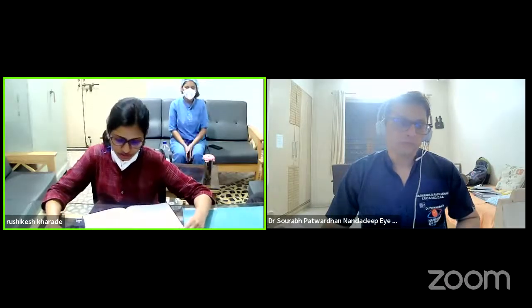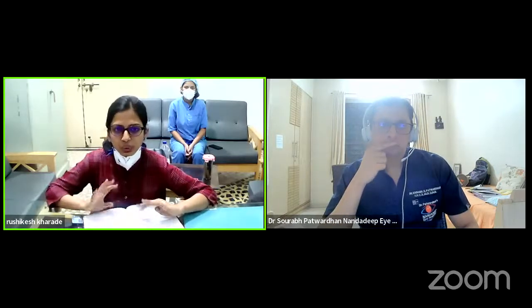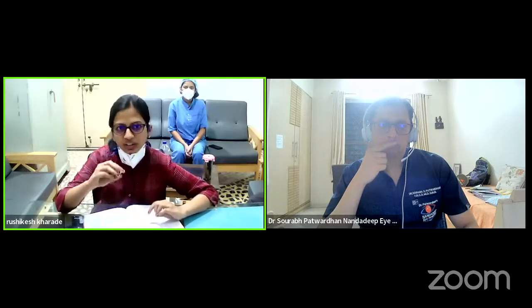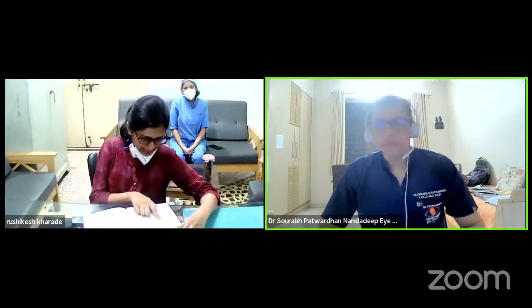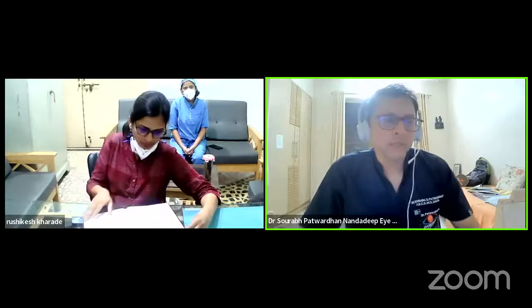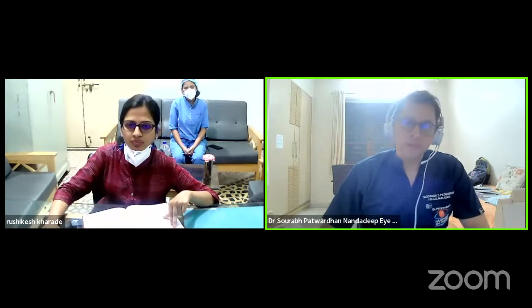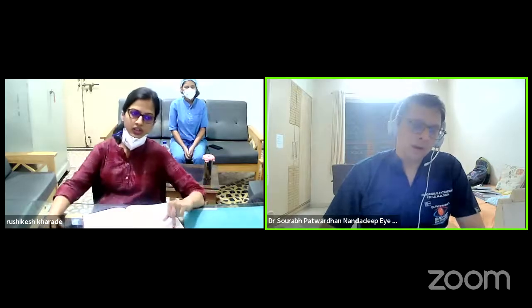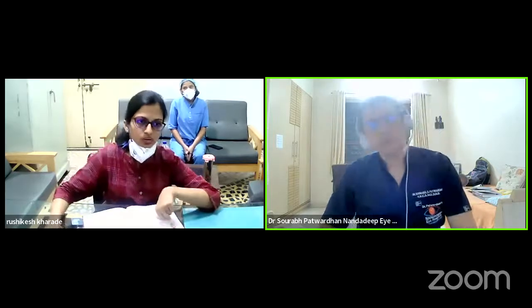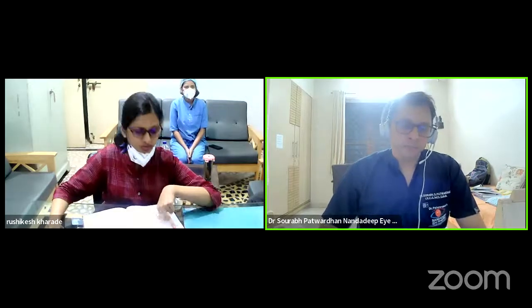One more thing, sir: I'm able to do chop only in the very hard grades of cataract. In grade 2 NS, I start, but chop is not possible, and I shift back to the trench divide technique. For very soft grades like grade 1 or grade 0, it's sometimes not possible to chop, but grade 2 onwards it's okay. Basically, you have to reduce the phaco power, and for harder grades you have to bury more. For softer grades you can bury less, so you don't have to go very deep.